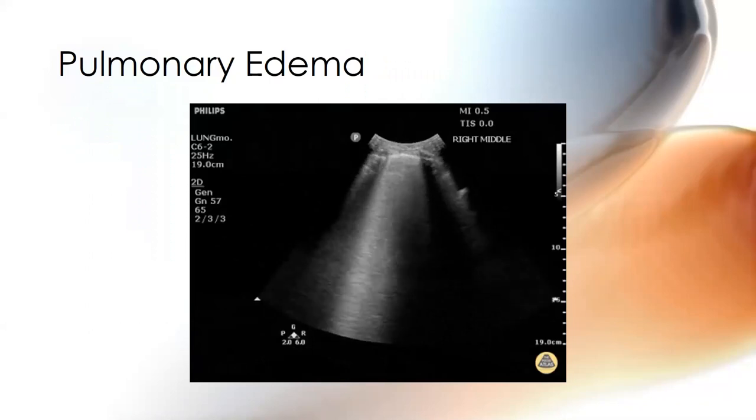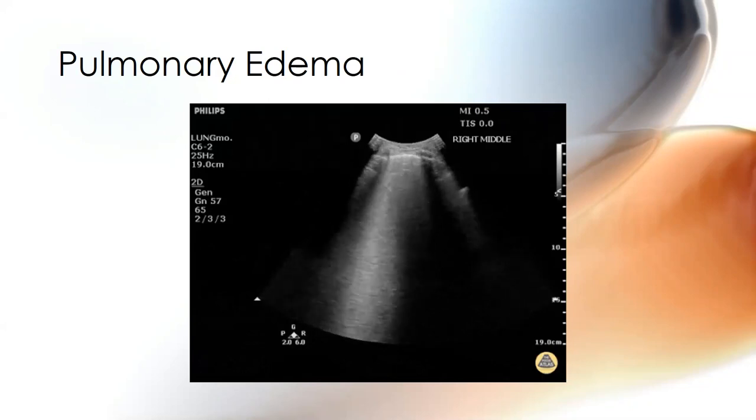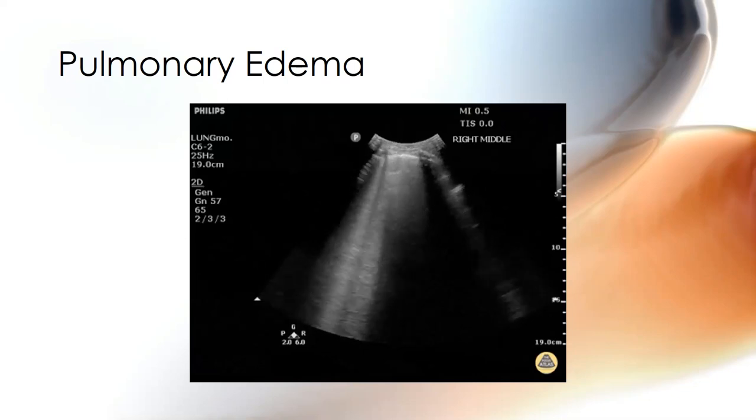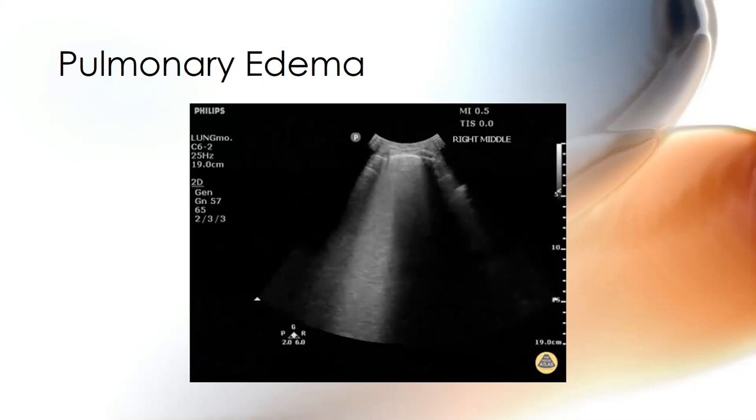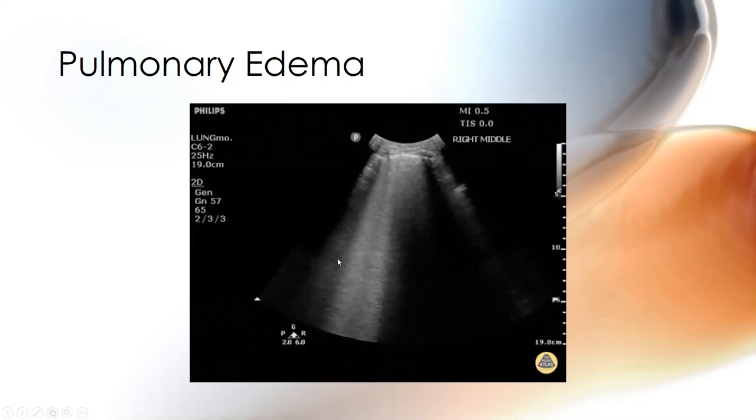What do you see here? And don't retype pulmonary edema because that's the title of the slide. What image artifacts do you see here? Anything else besides B-lines? Yep, big fat confluent B-lines. Actually, you can see two different ones here and some of them come together. So bat wing, I got rib shadow, pleural line. It is very clearly sliding because why? I can't really create that.